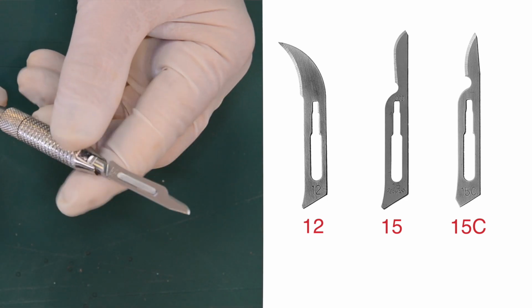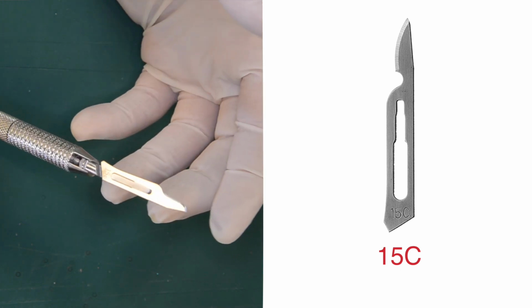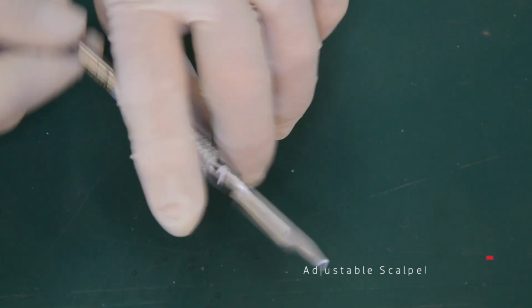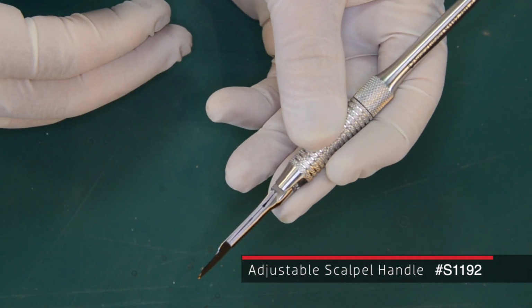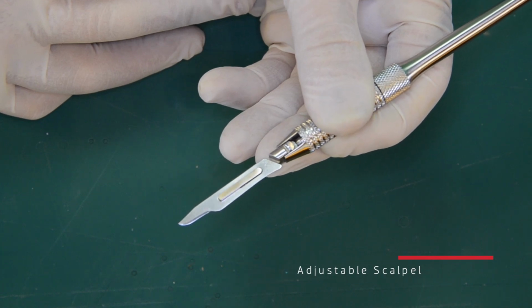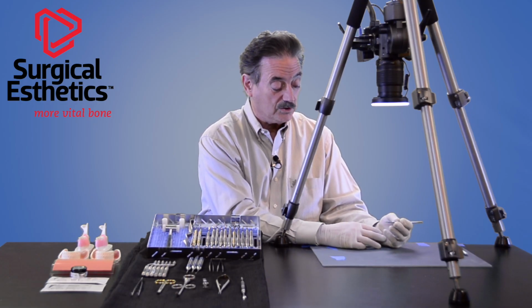On it we have a 15C blade, which again is a blade that we prefer over a 15 because it has a much smaller end to it. So again, you can see in using a round blade holder, you can make a slow, delicate turn without nicking the tissue. Almost impossible to do with a flat blade holder.